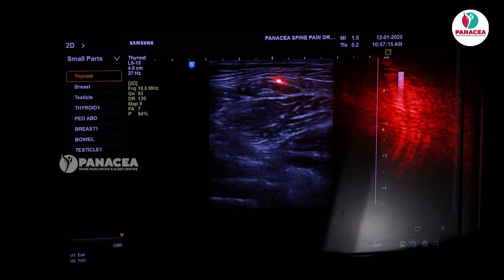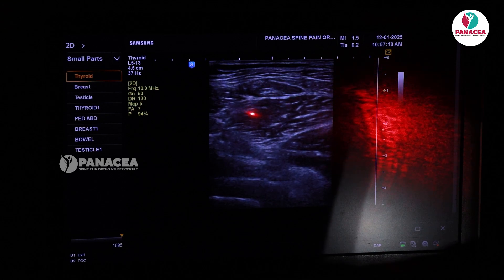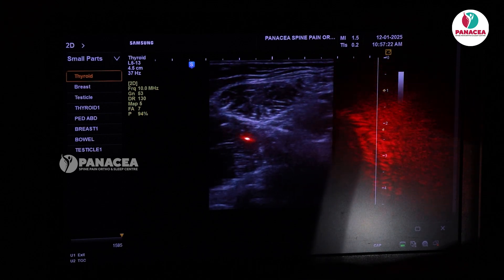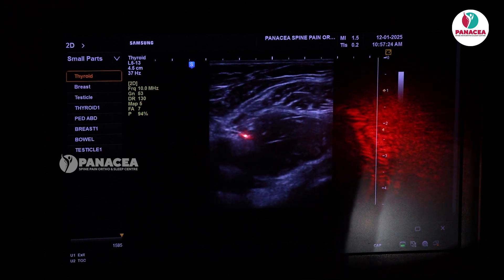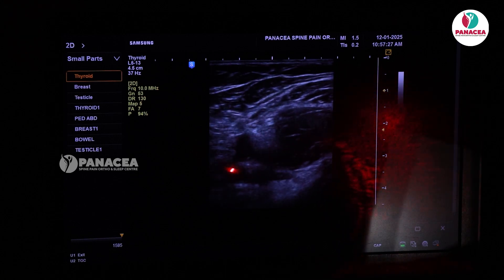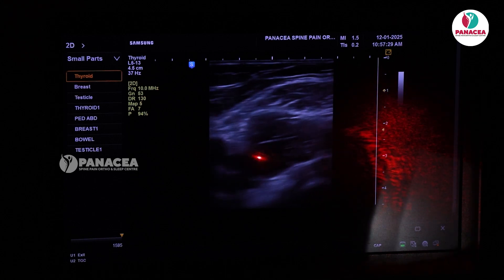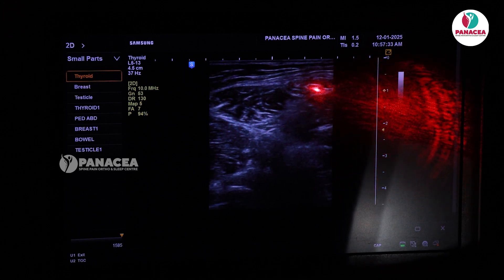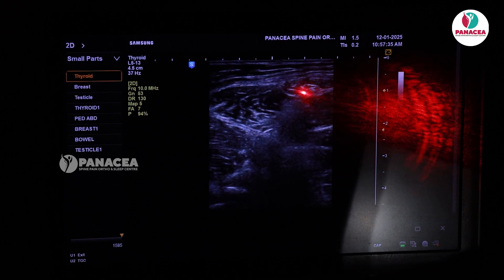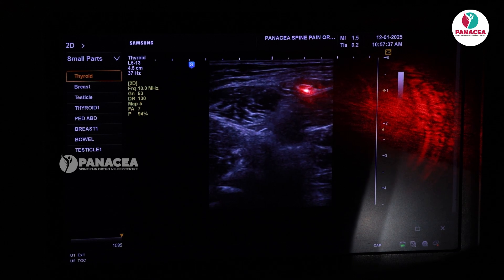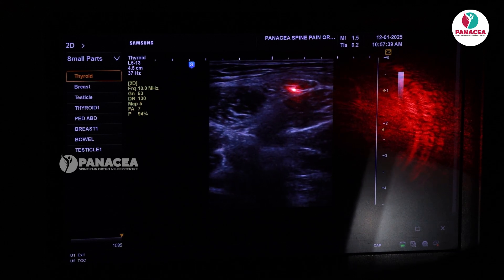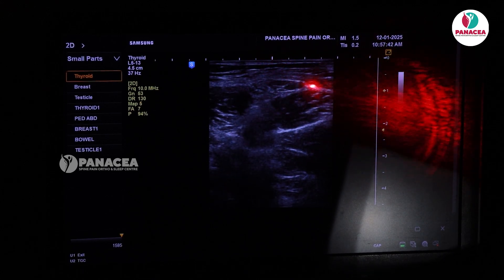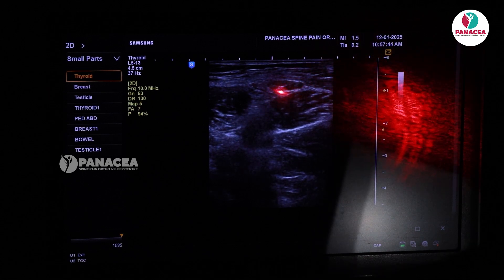This is the area for the block. This is tensor fascia latae and here comes the sartorius. This is the iliacus, femoral nerve, femoral artery, and femoral vein. Going back — you can see the sartorius here nicely. This is the LFCN, the lateral femoral cutaneous nerve, centered on the screen. We can now proceed from lateral to medial for the injection. The nerve is nicely traced out. On this side is the anterior superior iliac spine, this is tensor fascia latae, and this fat-filled flat tunnel contains the lateral femoral cutaneous nerve, with the sartorius and iliacus muscle.